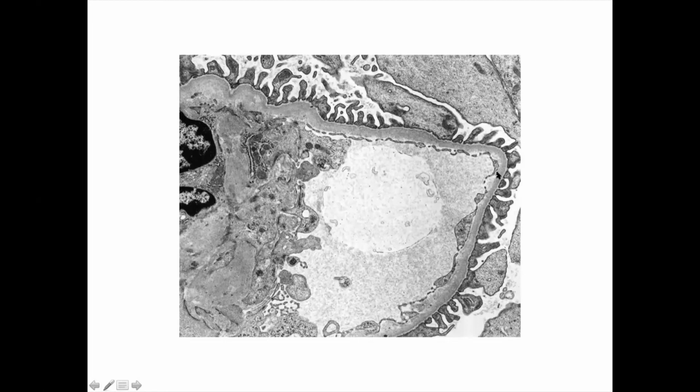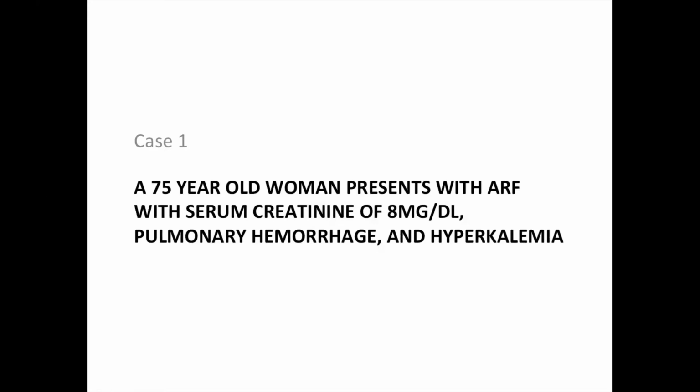The endothelial cells are flattened on the inside of the glomerular basement membrane, they're not swollen. And then we have a mesangial matrix, and then we have the mesangial cell, these dark nuclei. So this is just us reminding ourselves of all of that. So today I have 4 very interesting cases for you.